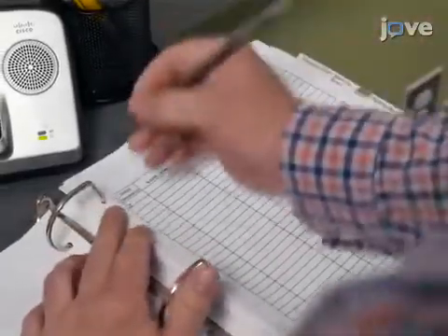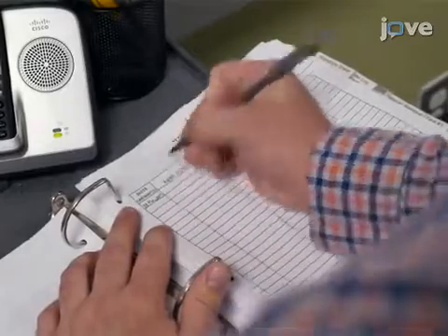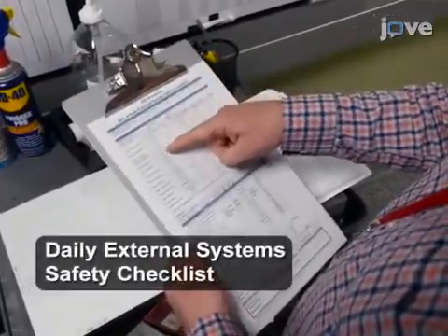Enter the staff person's name, time of entrance, laboratory location, and pathogens under study in the personnel entry-exit logbook. Indicate the laboratory location and check that the laboratories have been cleared for entry.